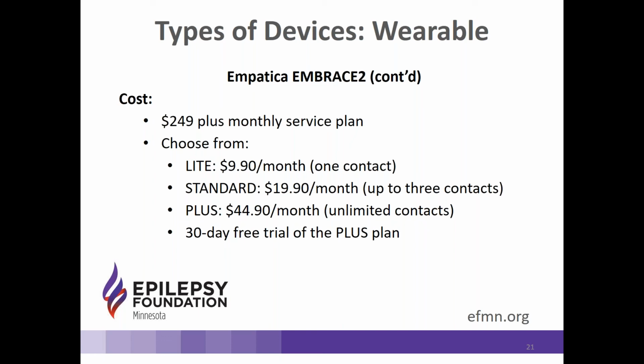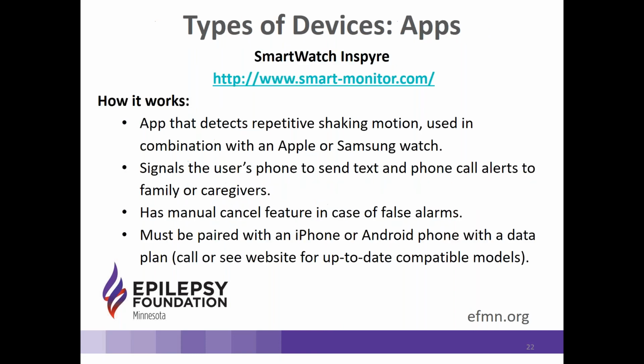It is not FDA approved. The Embrace is the only one that is. But if you're interested, I would just do a Google search on Epilert Seizure device, and you'll be able to find their website and kind of look at it. And they do have a form that you can fill out to contact them to get more information.